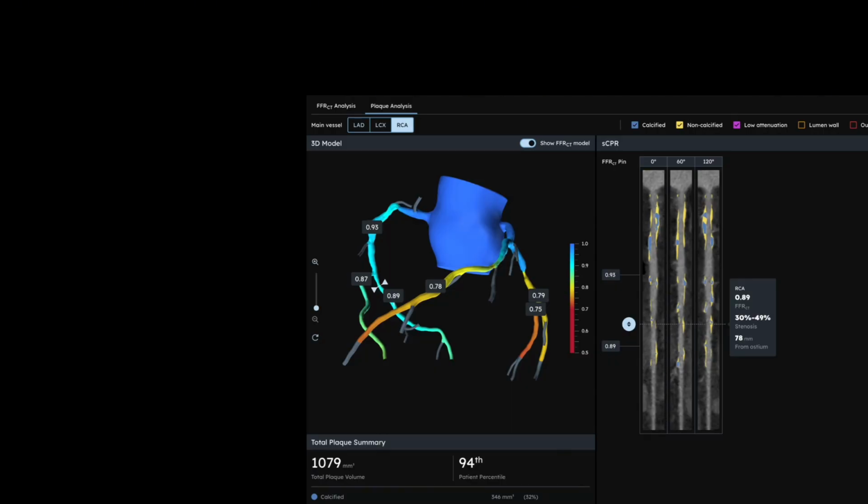And this is why CCTA with HeartFlow is becoming the new standard for cardiac risk assessment. Cardiologists are moving away from calcium scores and stress tests because those tests miss too much. They don't show you soft plaque, they don't measure blood flow as well as HeartFlow, and they can't guide precise treatment.